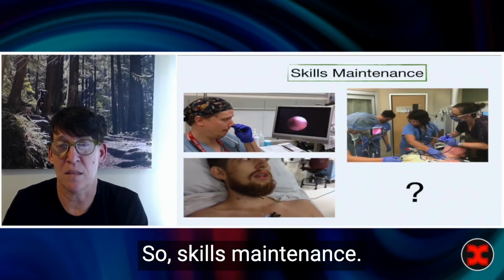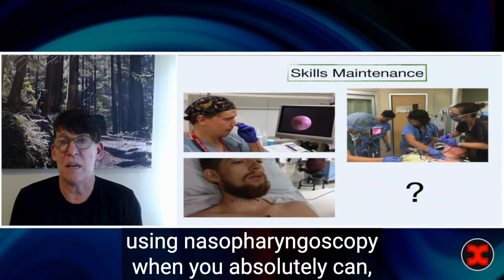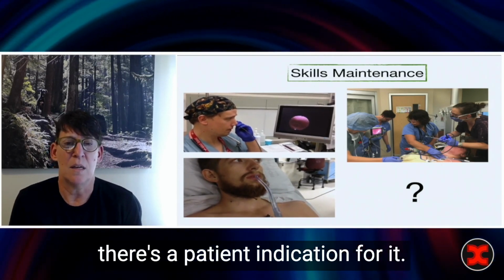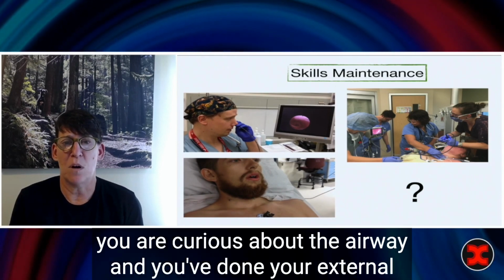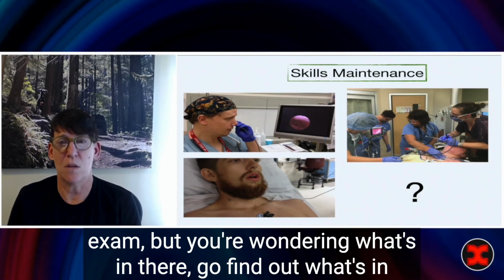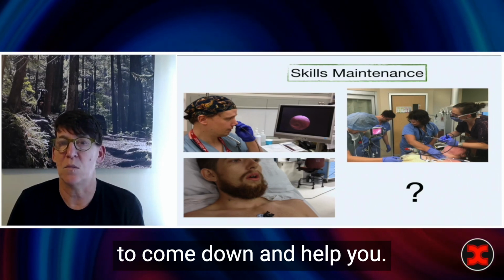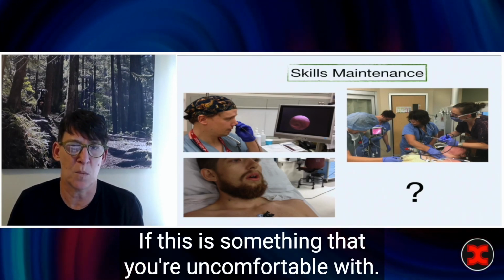So skills maintenance, as mentioned with trauma, skills maintenance is about using nasopharyngoscopy when you absolutely can, when there's a patient indication for it. So I'm not saying go around and do this for everybody, but if you are curious about the airway and you've done your external exam, but you're wondering what's in there, go find out what's in there. Use nasopharyngoscopy, and then get your colleagues to come down and help you do an awake intubation if this is something that you're uncomfortable with.